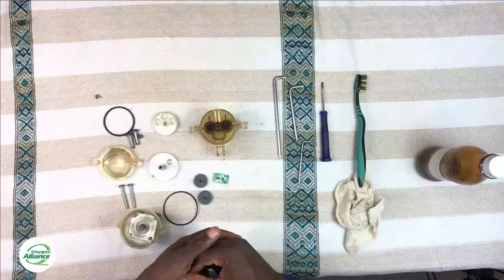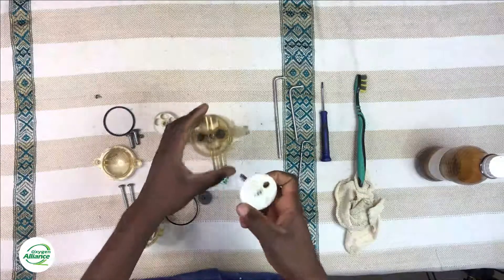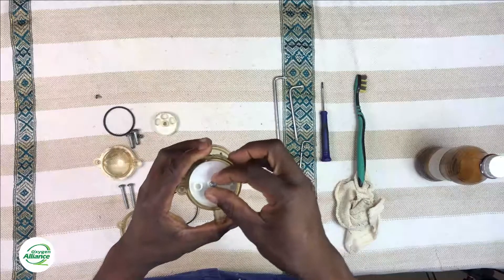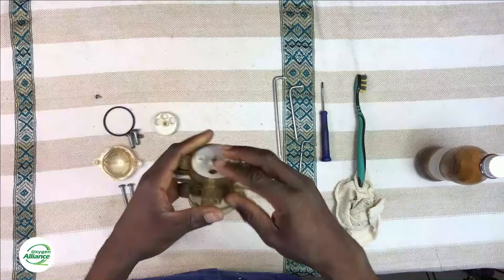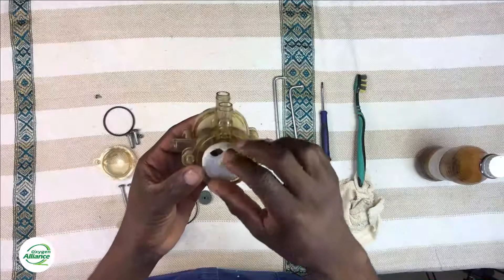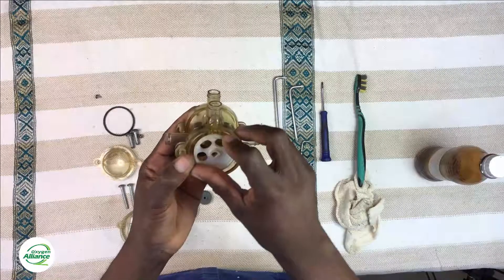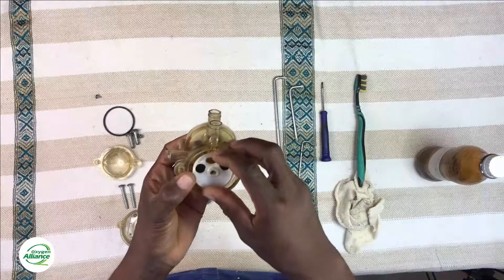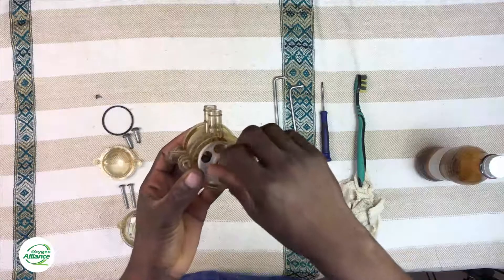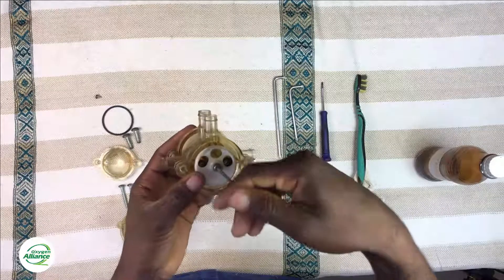Once the springs are nicely fitted, move on to putting back the other components. Start with the one-hole disc — just slide it in nicely, and once you feel it has reached its position, add the three-hole disc on the other side of the valve. Push it in and rotate it until it feels smooth, then replace the screw that holds the two parts together. Remember that we use a T10 Torx key to tighten this screw.